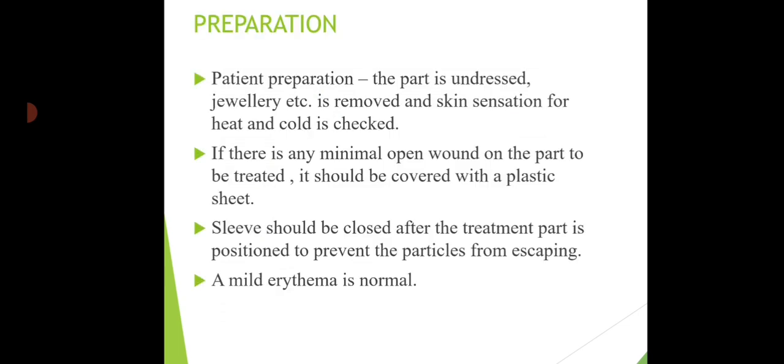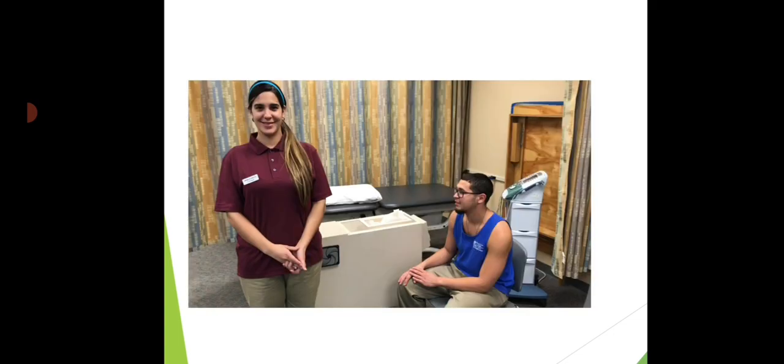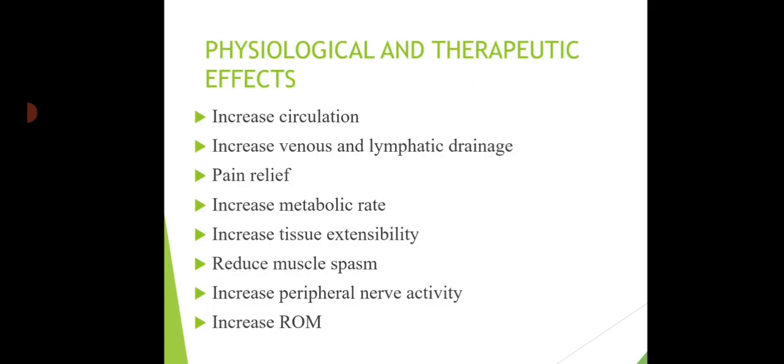Preparations. The patient's part is undressed, jewelry and everything is removed, and skin sensation should be checked before starting the therapy. If there is any minimal open wound that can be treated, it should be covered with a plastic sheet. The sleeve should be closed after the part is positioned to prevent the particles from escaping. And now, physiological and therapeutic effects.